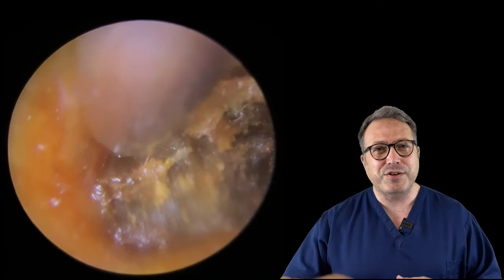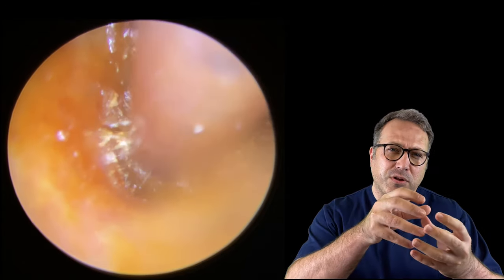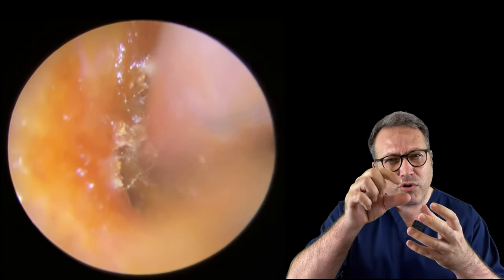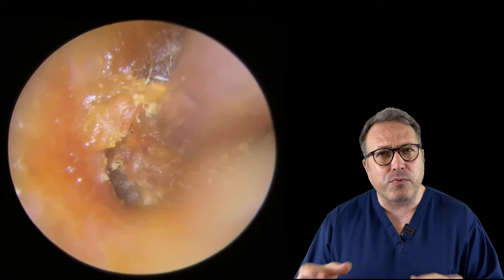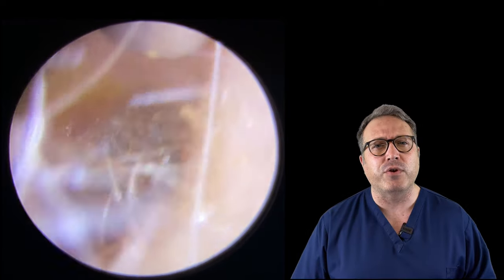So you can see we managed to break a little bit off - we introduced the crocodile forceps in there just a second ago and managed to pull a long strip of skin away. We were using the crocodile forceps just to grip that and see if we could pull the whole thing away. Sometimes you're lucky and the skin will have penetrated in there enough that it will pull the wax out for you.